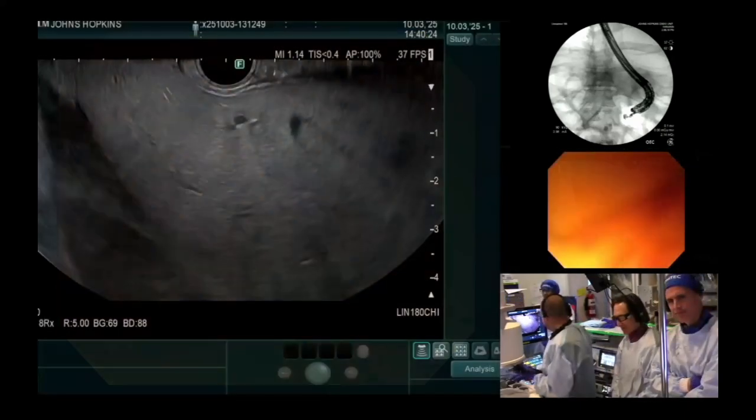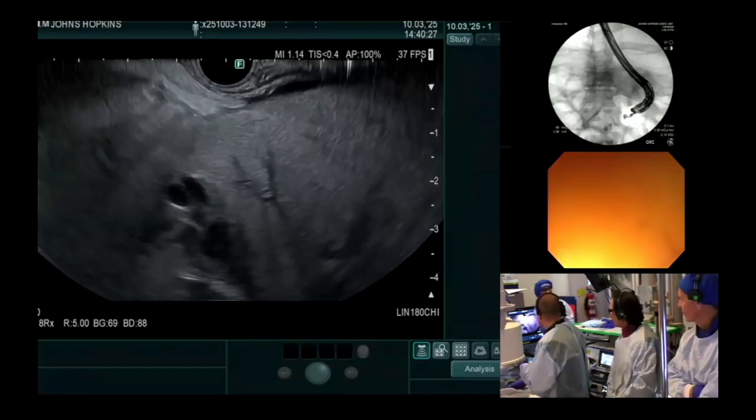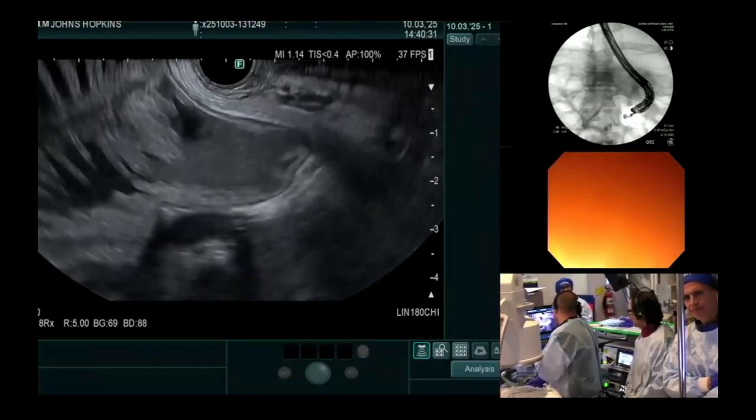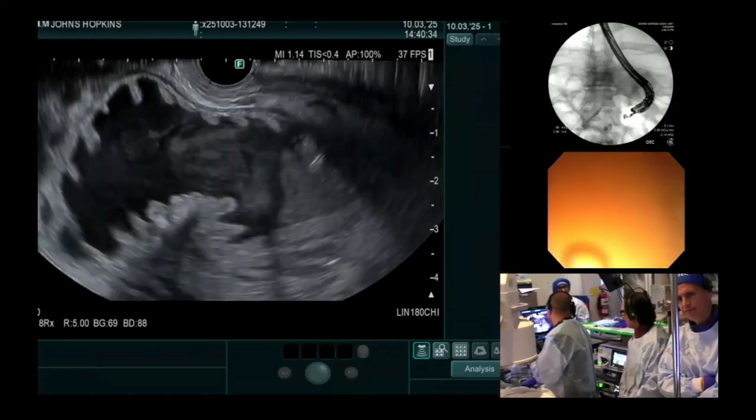Patient to STATS post-Whipple for pancreatic cancer with recurrence, comes with cholangitis because of afferent loop syndrome. So we see the liver, and if we follow towards the hilum or here hepatojejunostomy, we're going to see this dilated loop of small bowel.